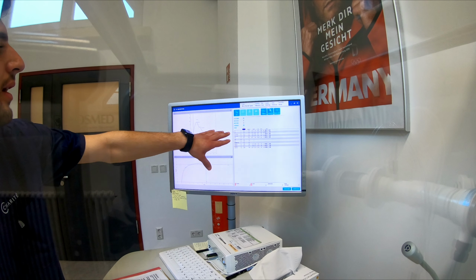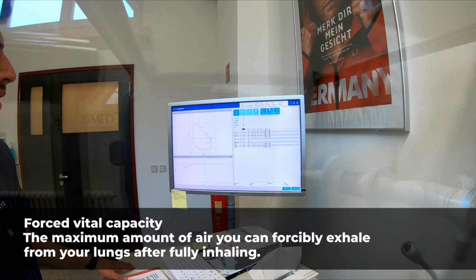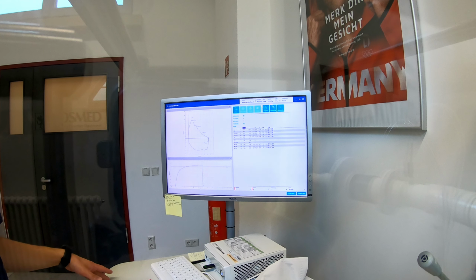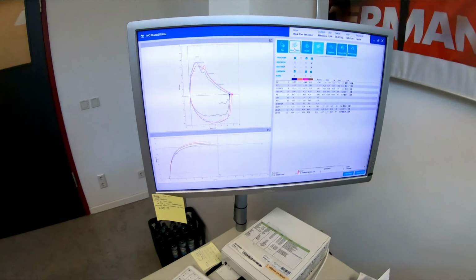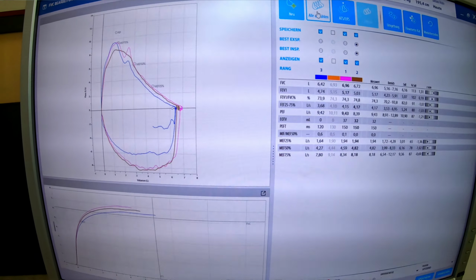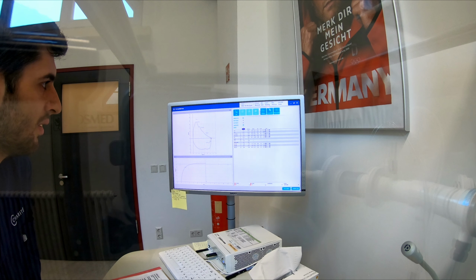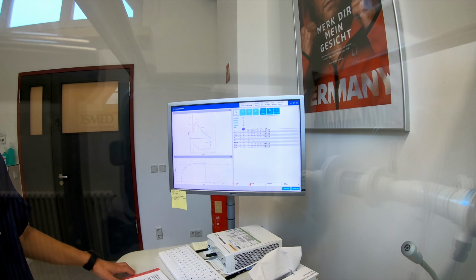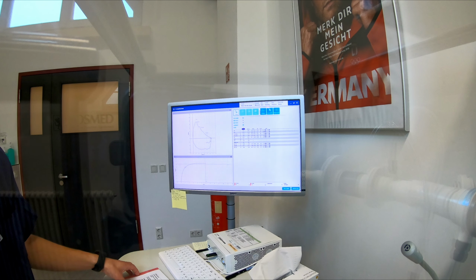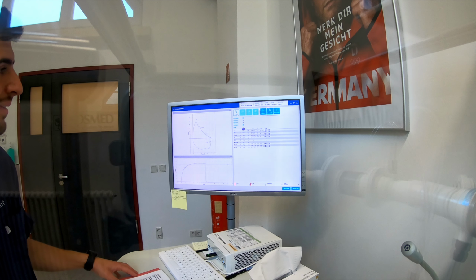The forced vital capacity, which is how much air you can breathe out when you force it, as the name says, is in the norm. One below is also okay, it's not so far from the norm. We will do this at least 2 to 3 more times. It might be getting used to it a bit as well. It's a bit odd.